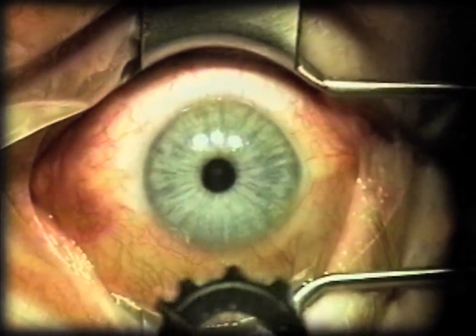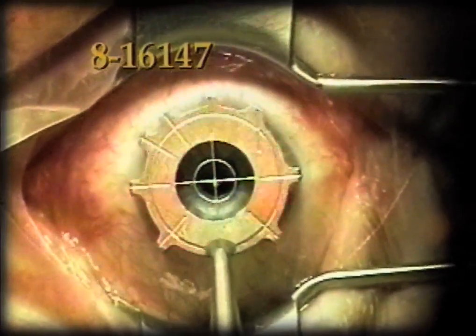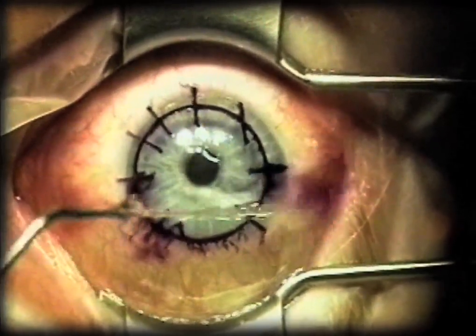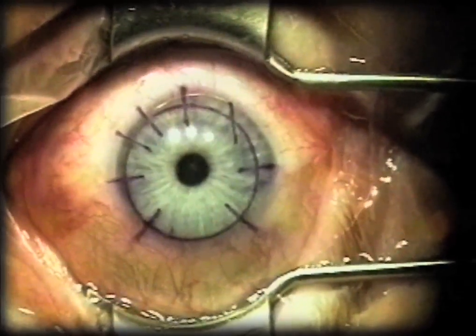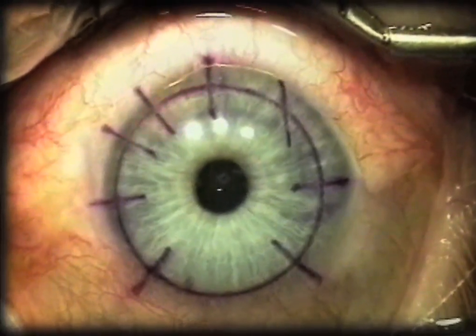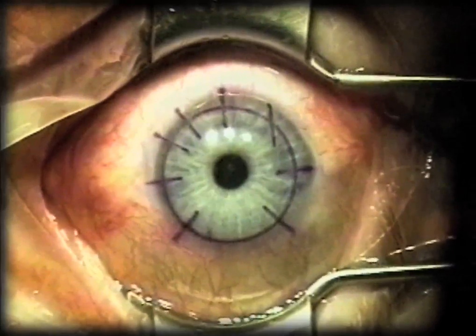I then use the marker. This marker has a crosshair to center on the pupil, and if you wish you can ink 360 degrees. The marks are oriented so that if you did get a free cap, you would know exactly which side was exterior and how to orient it. At the hinge area where the handle of the marker is, there are no ink marks. The marks are more closely spaced opposite where the hinge is located.